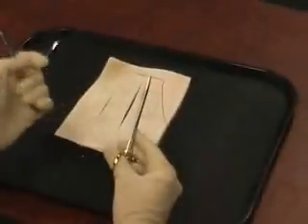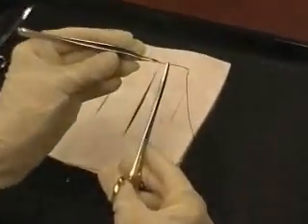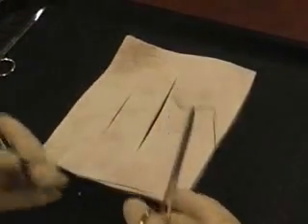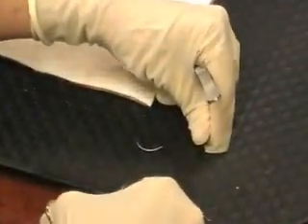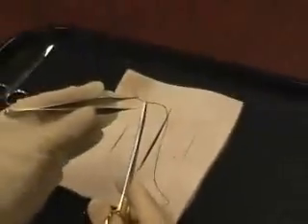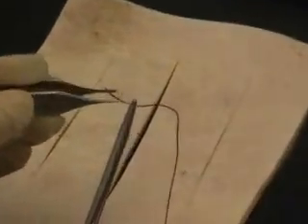If you're having difficulty, I really encourage you not to touch your needle, but instead to use your forceps to adjust the needle into place. The other thing is if you're really having difficulty, you can just drop the needle down as if it looks like a smiley face. I'm not sure if you can see this, it looks like a smiley face, and the point again is toward your non-dominant shoulder, and if you come straight down as if you were shaking hands and pick it up, you'll be again approximately in the right location. Then you can adjust if you need to.